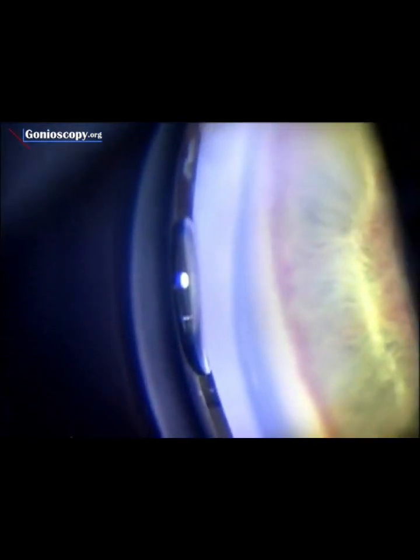I will now go to higher power and continue touring around the angle, looking at this lush network of vessels that fills the angle for 360 degrees. I can't recall seeing anyone in the past who had neovascularization of the angle that was visible so clearly on slit lamp examination. It's also remarkable that his iris elsewhere is not strikingly affected by neovascularization.